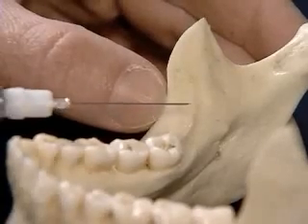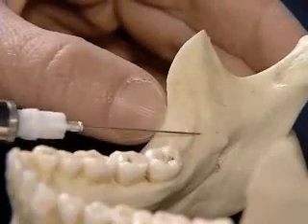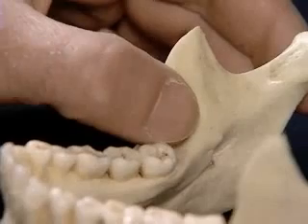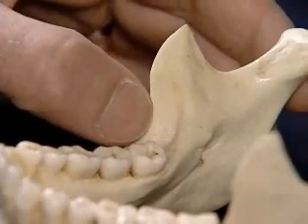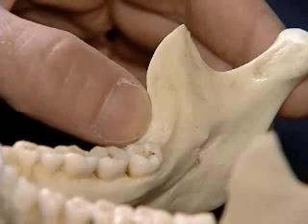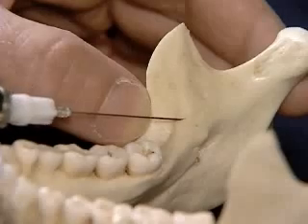The next stage is to palpate the internal oblique ridge, which is the next prominence as you move your finger or thumb in medially. That should be palpated, a mental note made at that point, and then your finger or thumb again withdrawn laterally, pulling the soft tissue landmark with you. It is just medial to the internal oblique ridge that the needle will be inserted.